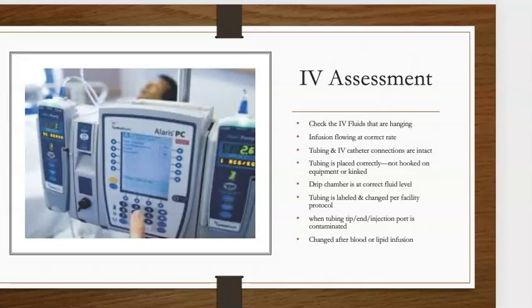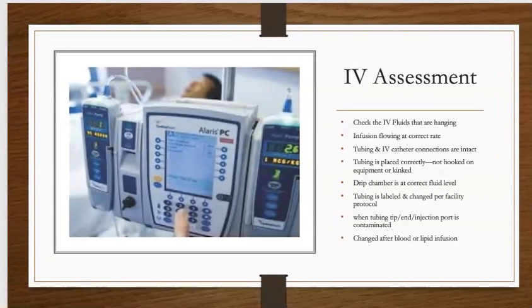You also want to be checking your tubing. Each facility has different protocols for their tubing. Please make sure you know the protocols for where you're assigned. The expectation for Professor Morales and myself is that when we walk in the room with you and we're giving IV meds, you've checked your tubing, you know if you need tubing, do you need a flush, do you need alcohol? Our expectation is that you're going to be gathering your supplies, and that's part of your critical thinking and clinical judgment.